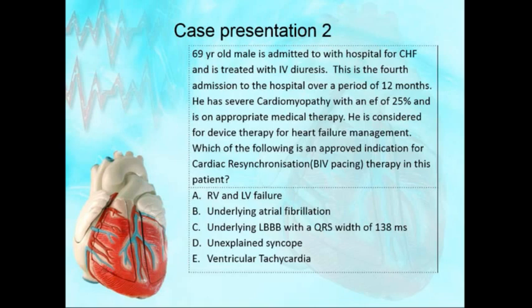When I was a resident, actually the trials were not even out. So if anybody talked about BIV, we would have said, oh, this is above my head, I'm not going to think about it. Even in 2006, 2007, not a question for internists. But when you start following MKSAP, 2009, 2010, they started talking about CRT. BIV is what you guys know commonly. BIV also stands for cardiac resynchronization therapy. So they want you to know the indication for a BIV ICD. You not only need to know about ICD, you need to know when you put a BIV ICD.